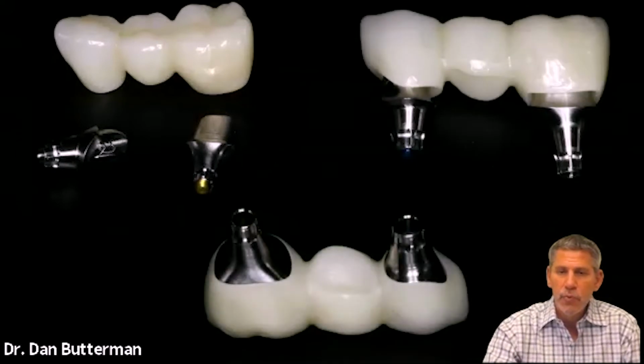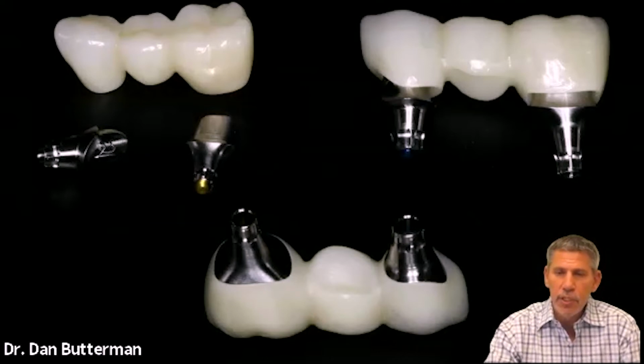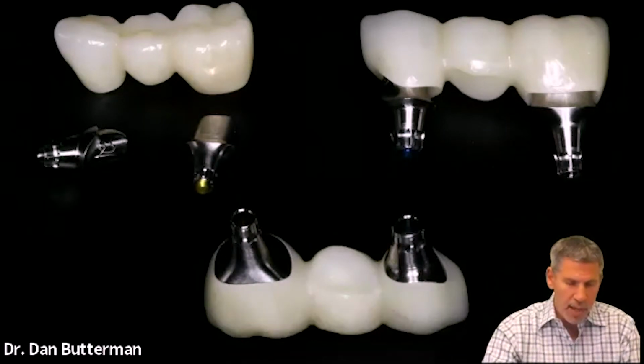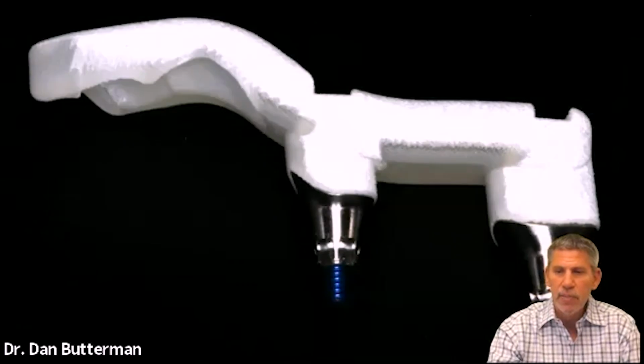So here you can see this was done out of Katana zirconia, and those are the couple of abutments that Atlantis sent back. This was the bridge that I milled out, and the cool thing is that this stuff just fits together. I'll spend a bit more time talking about Atlantis in a minute.